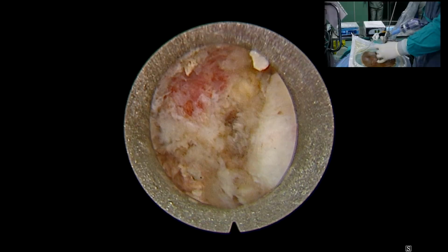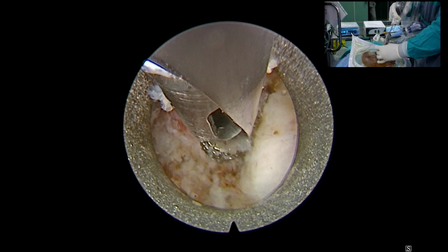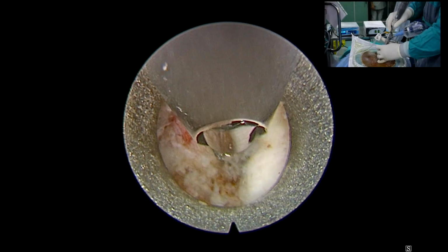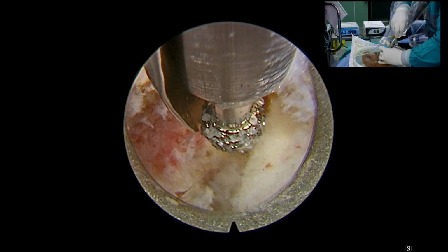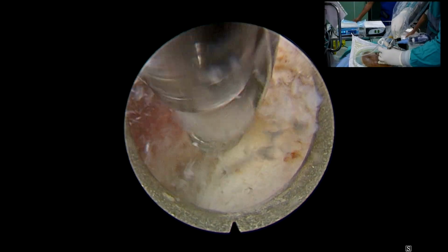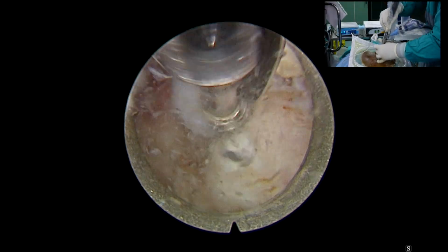We use the RF now in case there are bleeders. See, now they've put a. No, it's still the upper lamina, the edge of the upper lamina.